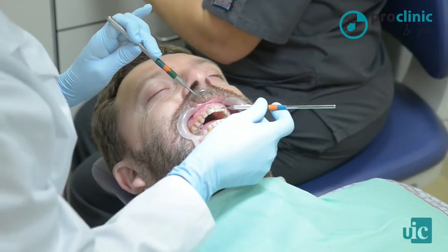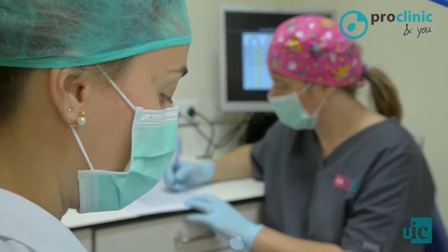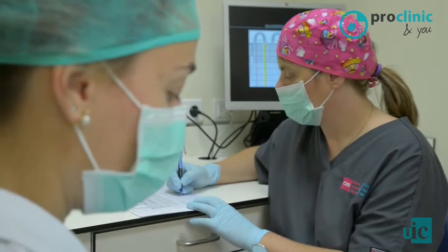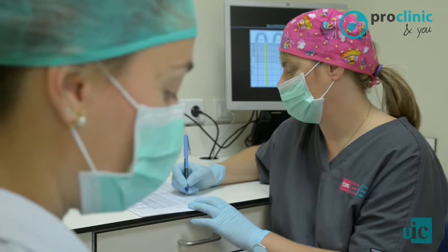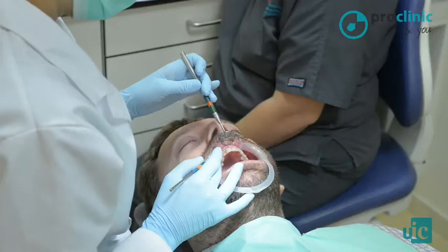2, 2, 2, 2. And the same at palatal. We are starting at tooth 2.3 distally.